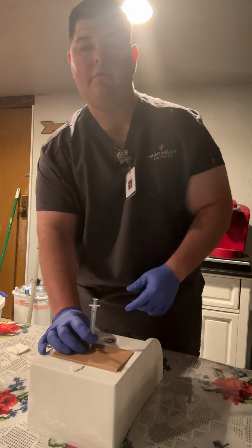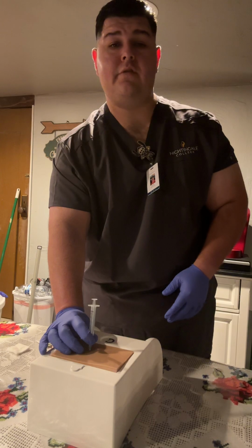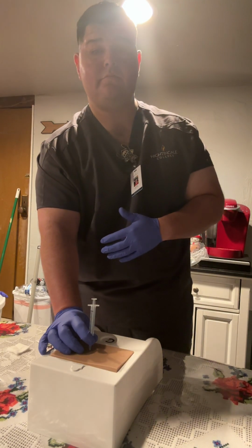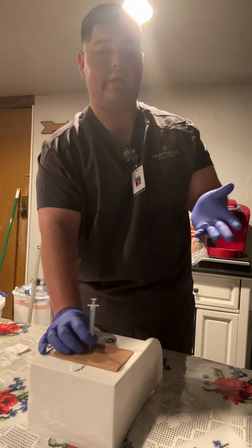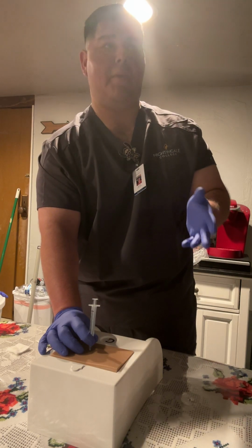Okay. I'm done injecting the medicine, and I want to leave the syringe for 10 seconds before removing it. So now I'm going to remove the needle after the 10 seconds are up, and I'm going to release the skin and place the gauze pad on top.